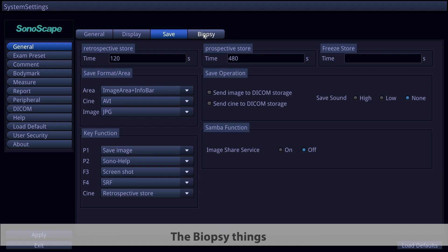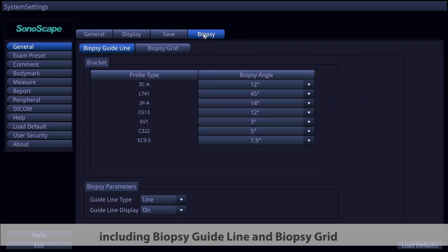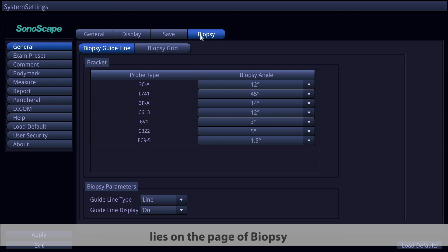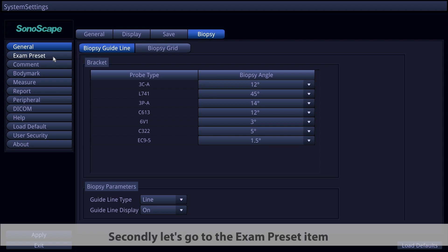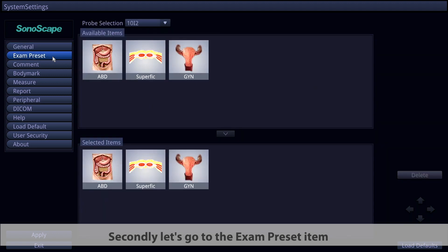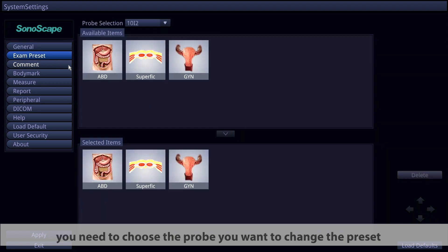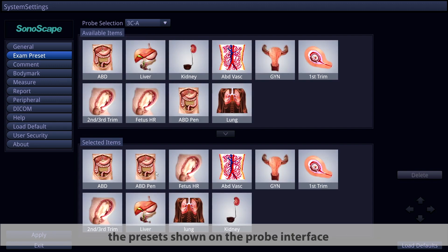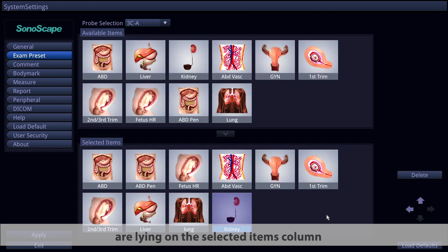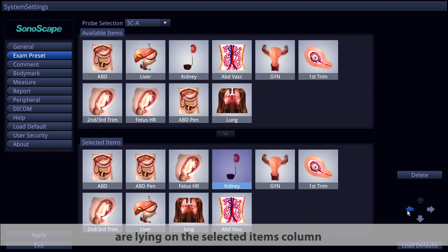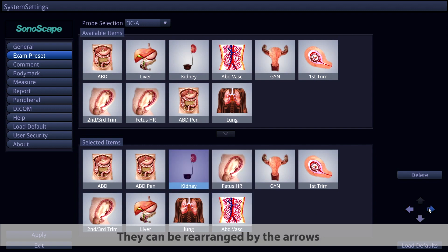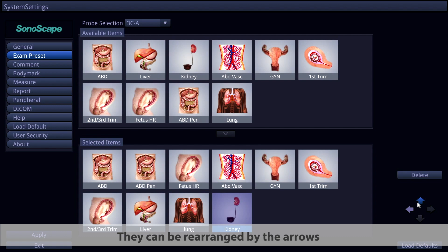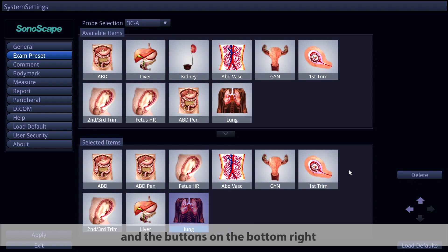The Biopsy page includes biopsy guideline and biopsy grid settings. Next, go to the Exam Preset items — choose the probe you want to configure. The presets shown on the probe interface are listed in the selected items column and can be rearranged using the arrows and buttons on the bottom right.